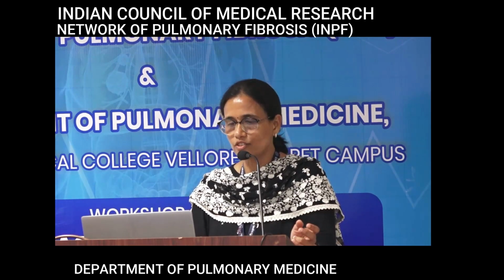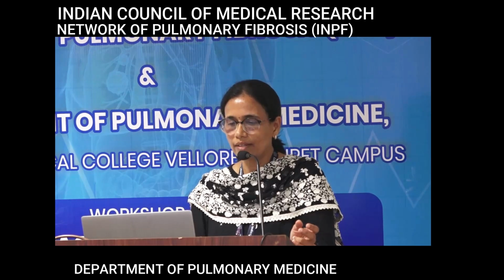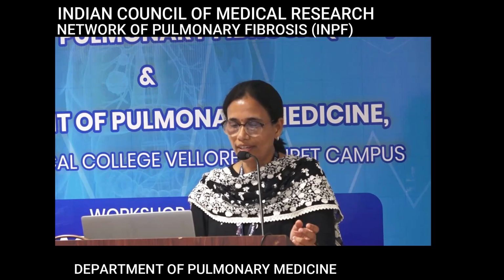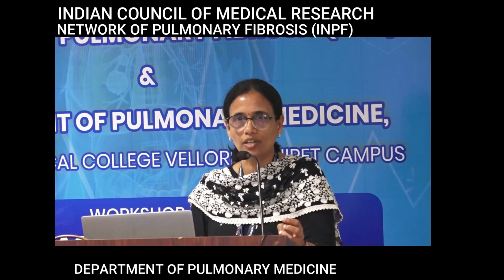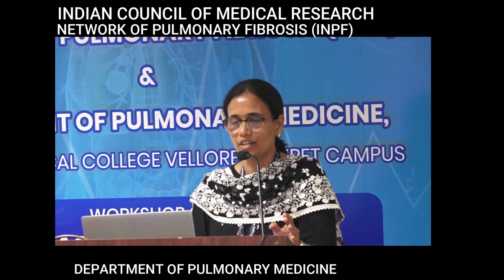So again, what is the distribution? Look at the pleura. Are there nodules along the pleura? No, they are just away from the pleura, just separated from the pleura. So this is a centrilobular pattern, and they are ground glass density nodules.